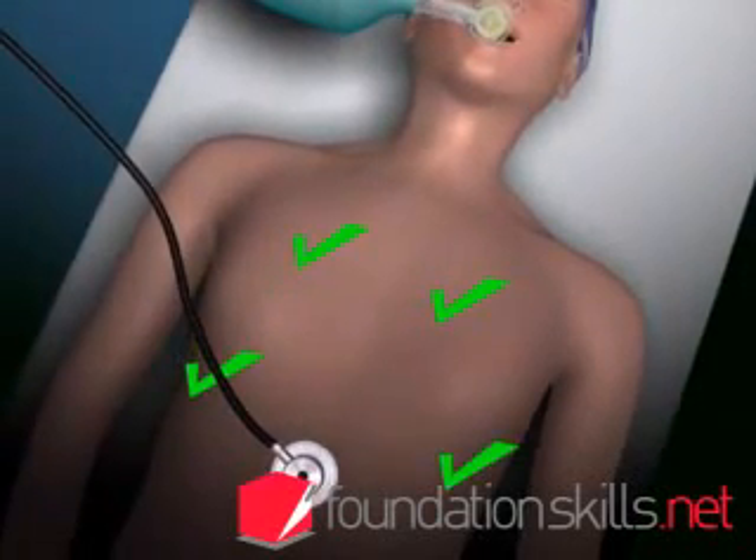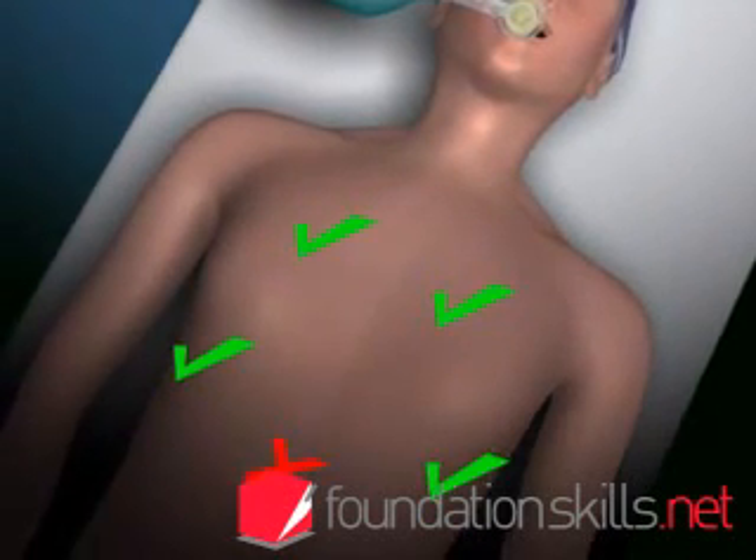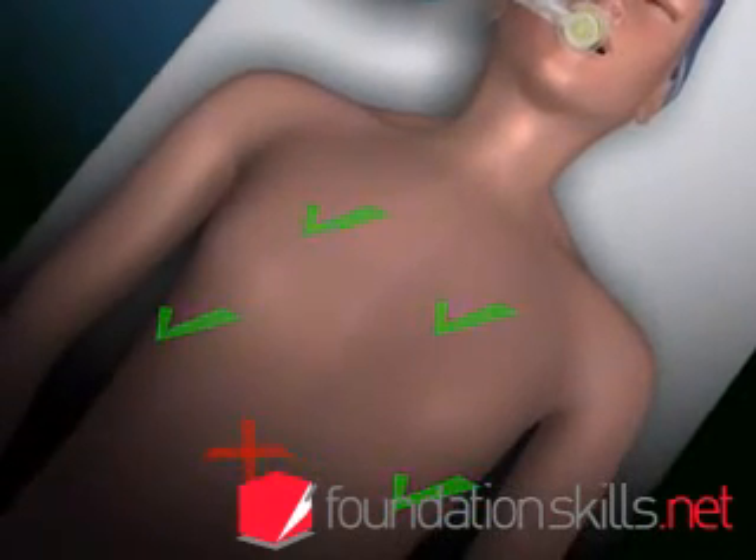If it is not in the correct position, deflate the cuff and remove the tube. Resort back to bag and mask ventilation and repeat the intubation process from the beginning.